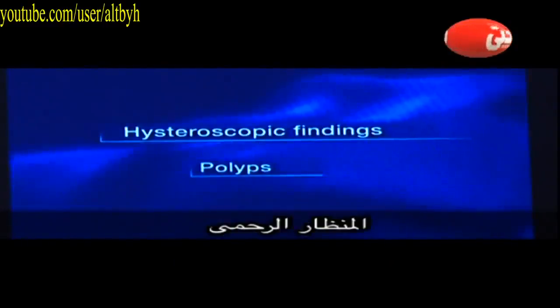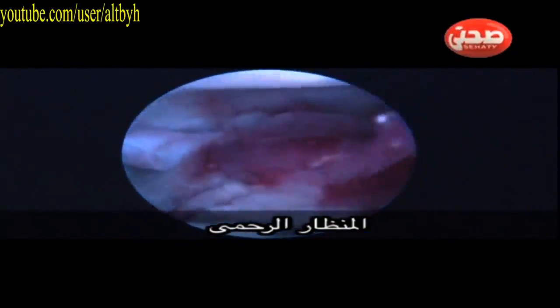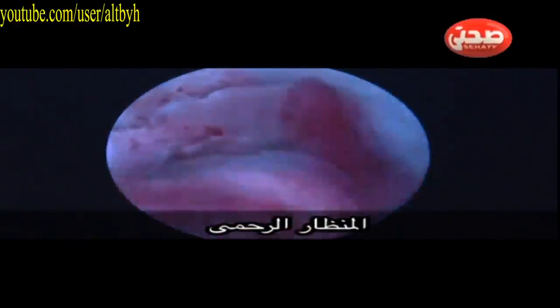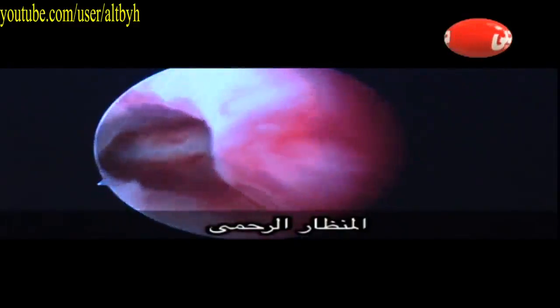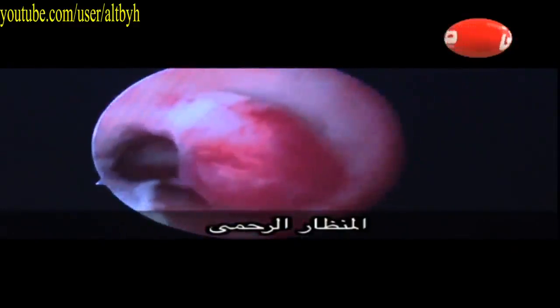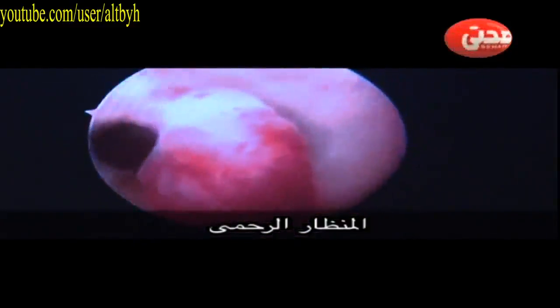Polyps are very common in hysteroscopy, and as you can see here, this is a polyp with a lady with menstrual disorders, and the polyp is seen and it's pedunculated, and you can easily remove it. This is another example of a polyp which is protruding to the lower part of the cavity, and as you can see here on the top, this is a fundus and both ostia, and the polyp can also be easily removed by polypectomy or resectoscope.